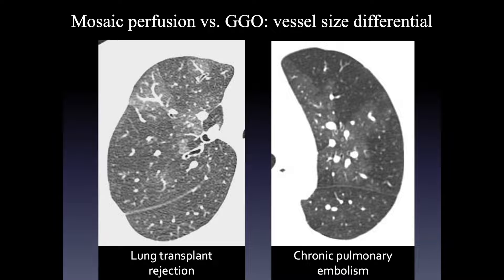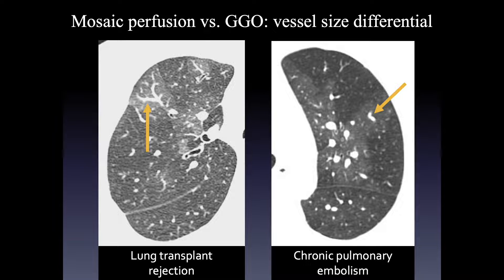Vessel size differential is helpful when you see it, but not helpful when it's not present. In these two cases, we see much bigger vessels in the more normal opaque lung and much smaller vessels in the abnormally lucent lung. That difference in vessel size really helps predict that the lucent lung is abnormal and the pattern is mosaic perfusion.